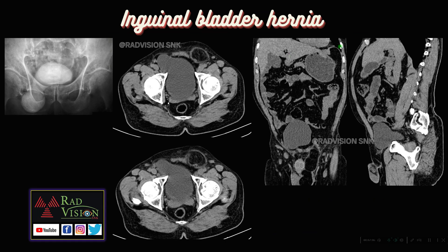Next, you can see bilateral inguinal hernias, but here part of the bladder is herniating into the right inguinal region — this is called inguinal bladder hernia. On IVP, you can see the herniation of the bladder into the right inguinal region. Remember inguinal bladder hernia, and the close differential will be urinary bladder diverticulum.